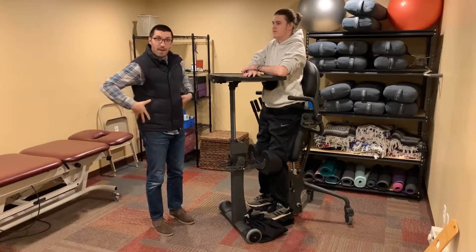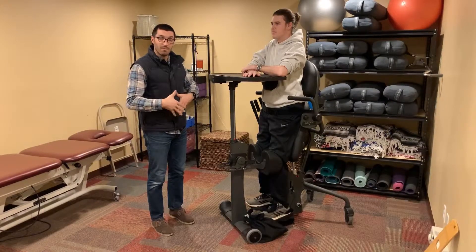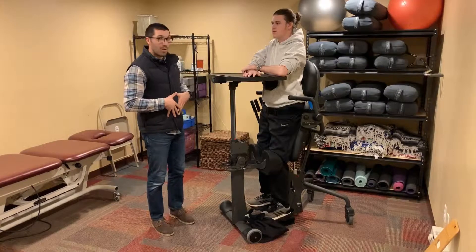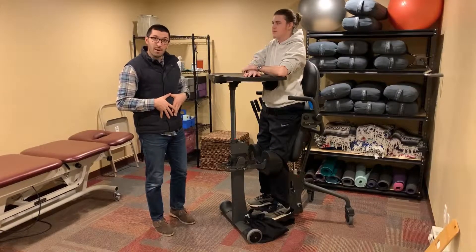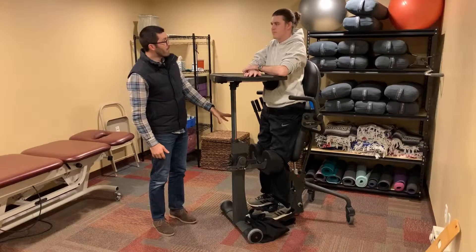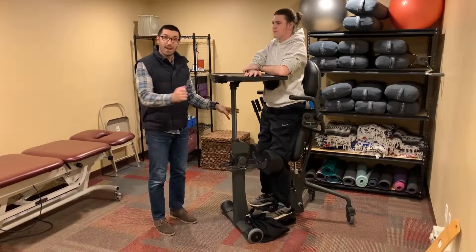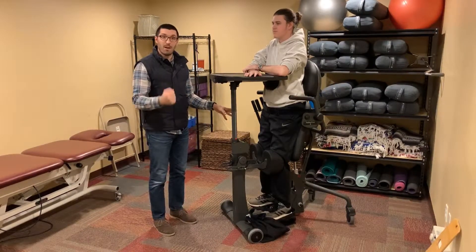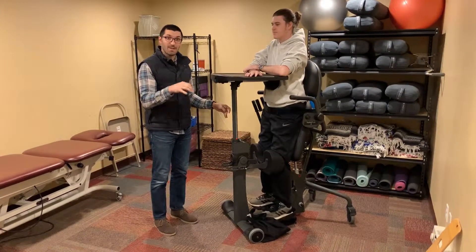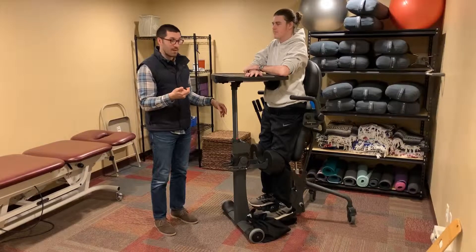Trev is wearing an abdominal binder right now that is going to provide some dynamic compression to his abdomen. We've been able to graduate away from ted hose and ace wraps around his lower extremities, but we did start with ted hose and ace wraps, so we had static and dynamic compression to the lower extremities.